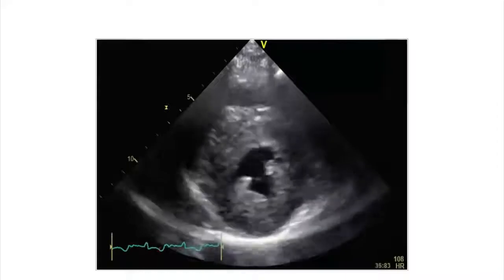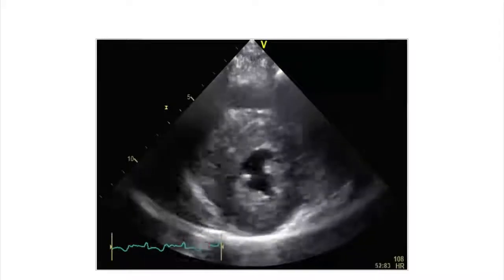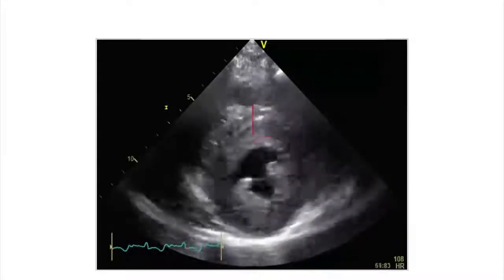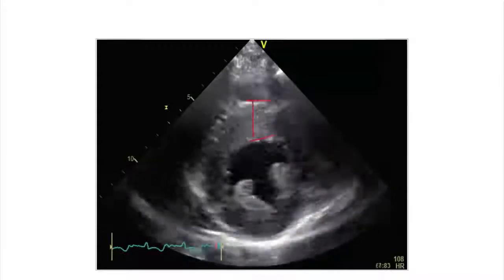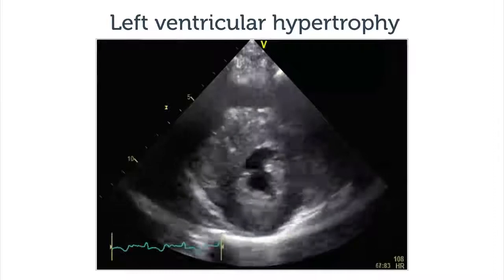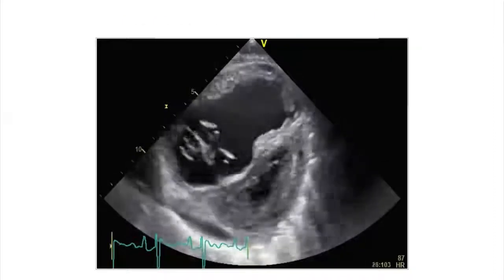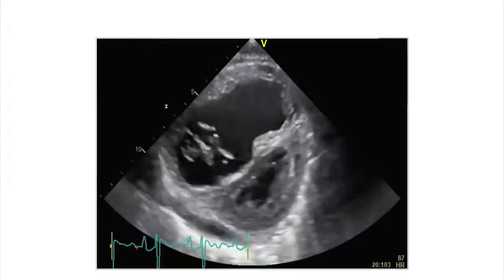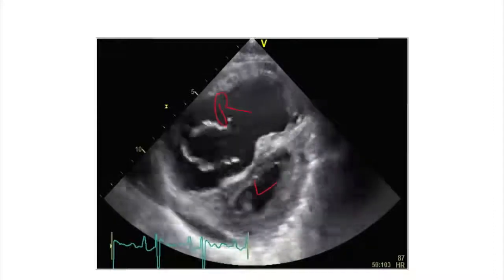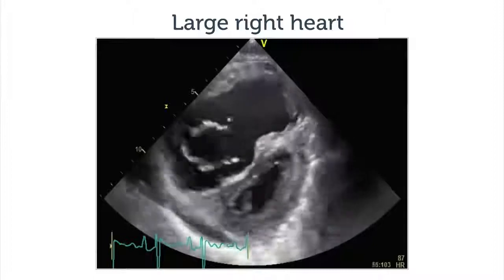Look now at this ventricle — still a relatively good function. But we have another problem here: the thickness of the myocardium, which is increased. We have a case of left ventricular hypertrophy. And to end, this is definitely not a good heart. We have a relatively small left ventricle in comparison to a huge right ventricle. This is a really clear case of pulmonary hypertension.